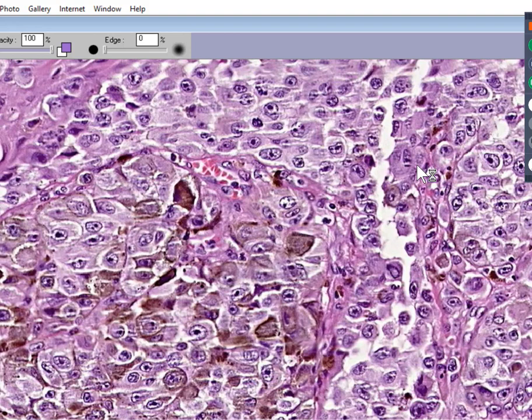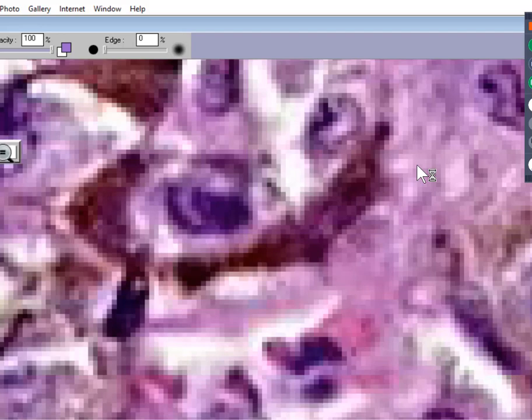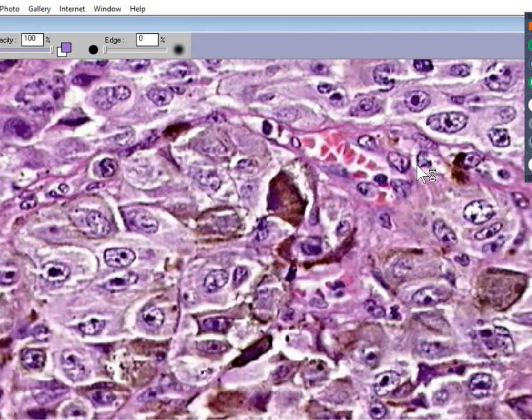Look, I'm going to show you something on this slide here. This particular nucleolus, which I'm going to zoom in on. Whoops, that's too much. This particular nucleolus here, and here, and here, and here. These nucleoli are so big, they're probably as big as the nuclei of most other cells, and they are pigmented as well. Now, can I ask you a question?